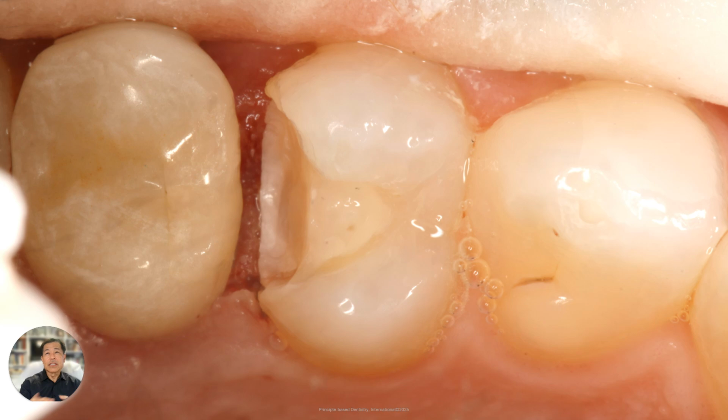If I'm using a cord, as I showed in one of the last programs that we did, I put my QuickStat Free onto the cord. I use the QuickStat Free as like a lubricant, so I can slide it down into the sulcus better. And the QuickStat Free gives me my hemostasis, and I let it sit there for a minute just to stretch the tissue out. Then I pull the cord and I take my intraoral scan or my impression, whatever it may be that we're doing. But to me, this is the kind of result that I get with QuickStat Free, where we will go from that heavy bleeding, pooled areas of blood, apply the QuickStat Free, rinse it off, and now I can see whatever I have to see.